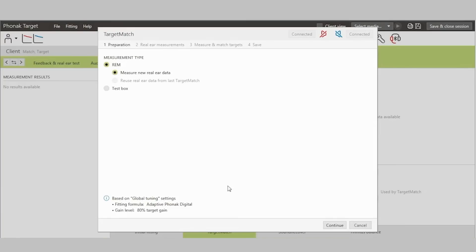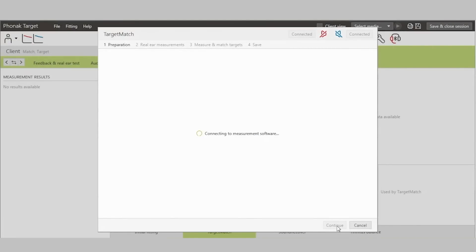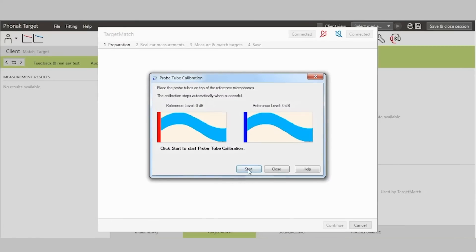For this video, we will measure new real ear data. From within Target, the software for running the Autometrics Verification Equipment has automatically been started. I can now perform tube calibration by pressing Start.